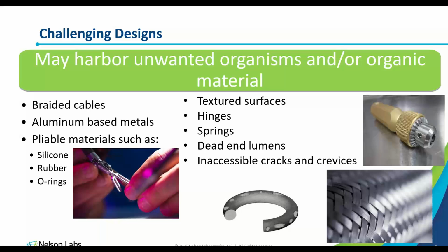It'll help you to ensure you have effective and efficient reprocessing validations, and it also will make your device more appealing to hospitals and healthcare facilities, because it is able to be effectively cleaned by the technicians in the sterile processing departments. And so that was the groundwork, or the baseline, I wanted to establish. At this point, I want to turn the time over to you all to ask any questions about design development, or design in reference to reprocessing.